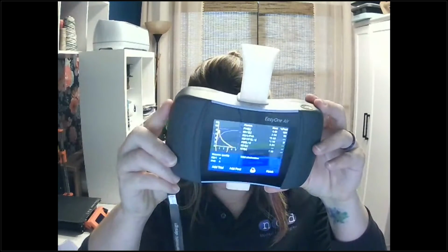All right. If you are printing directly from your EasyOne Air device, so you are not utilizing your computer at all, this is completely standalone, which I know is what so many of you do. From the results screen, we would pop out our single patient use mouthpiece and throw that away.